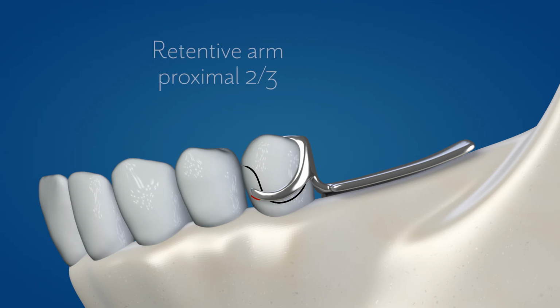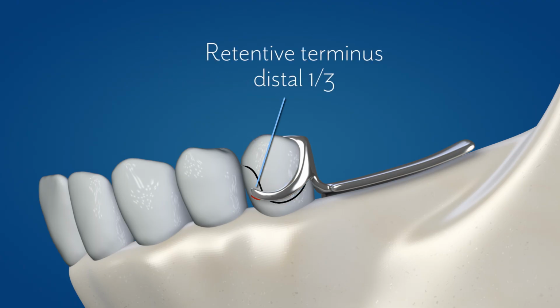Please note that the proximal 2/3 of the retentive arm is located at or above the height of contour, while the retentive terminus projects below the height of contour to engage the measured undercut.